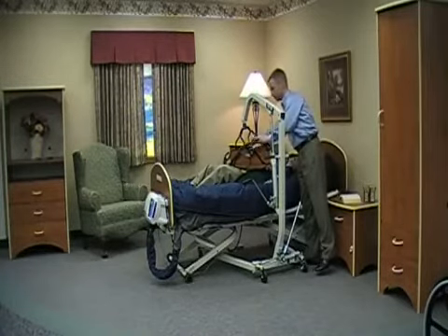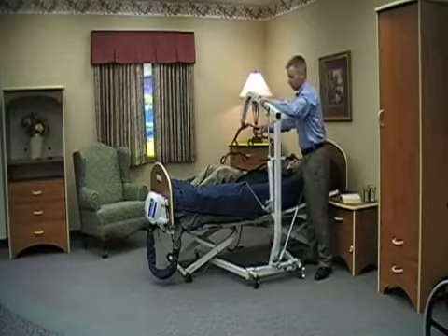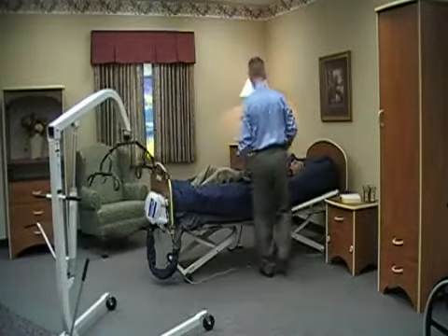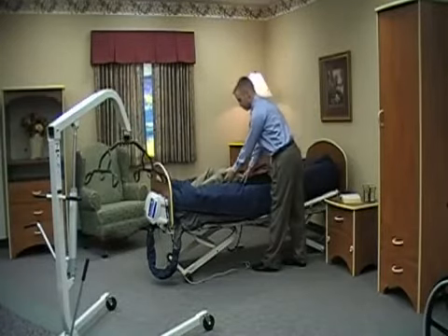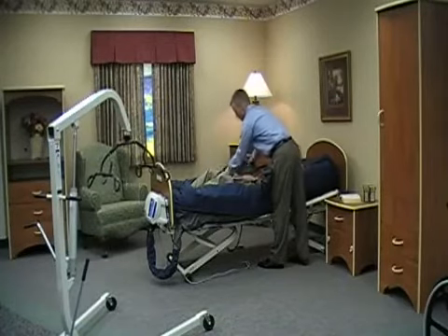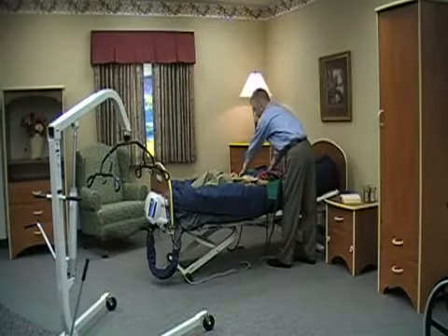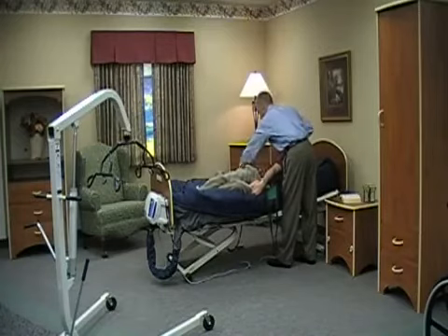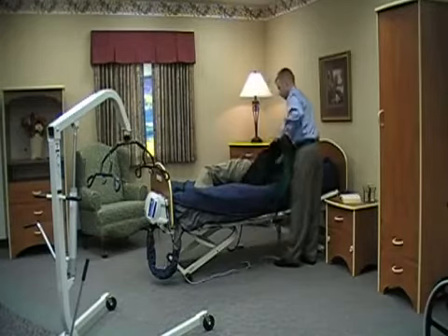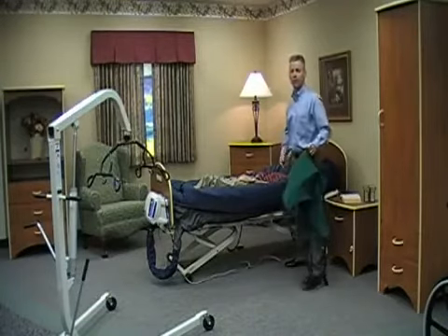We're going to remove our sling straps, remove our lifter, and then begin to remove our straps. The way we remove the sling in the bed is simply the reverse of how we applied it — uncrossing the leg straps, drawing one side out, drawing the other side out, and then simply doing a log roll. If I have a partner, I can roll the resident to me, tuck the top half underneath, roll the resident away from me, and remove the sling. Ensure that the resident is comfortable and in the appropriate position, and then we can go on to our next task.